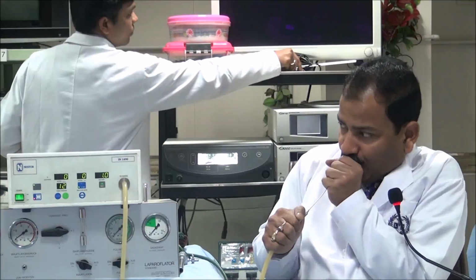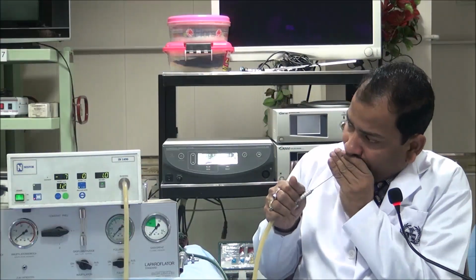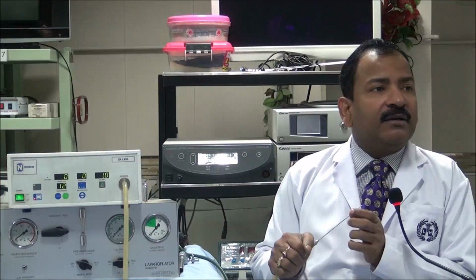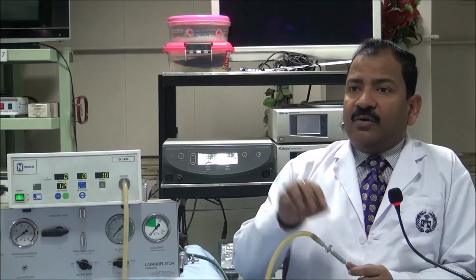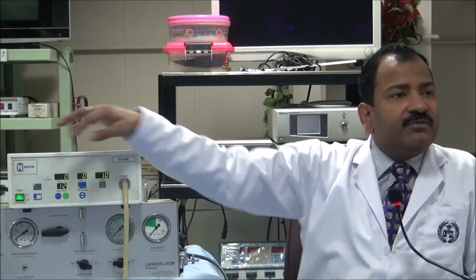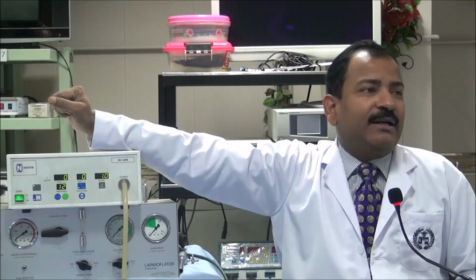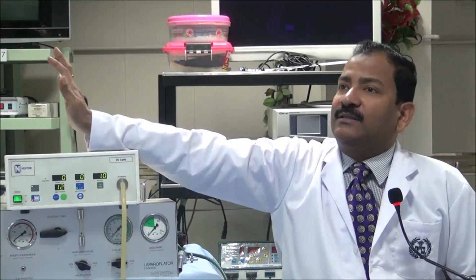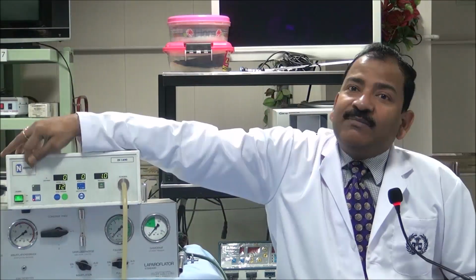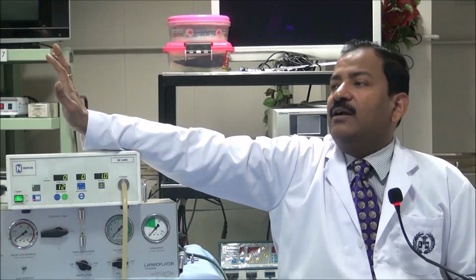I will show you. See, the negative was coming. Can you see that? Okay, negative. So without starting the flow, if you see -1, -2, that means you are in the abdominal cavity, because by default, the abdominal cavity has a negative pressure. And then once you see -2, -3, and you confirm, then you start the flow.